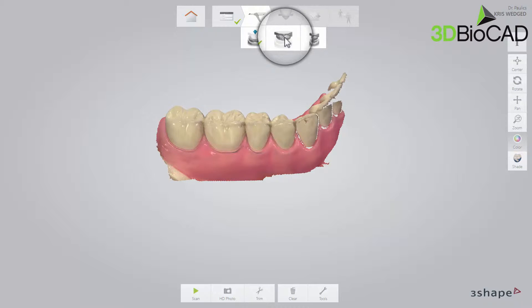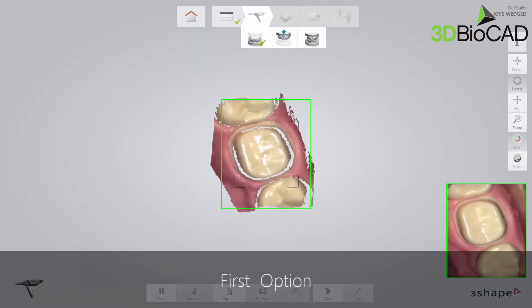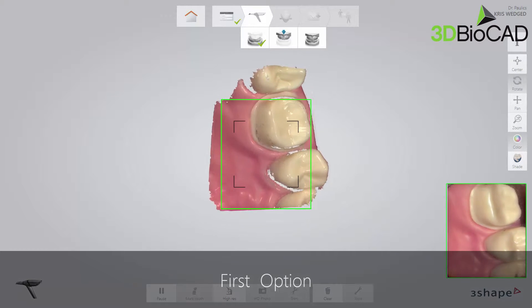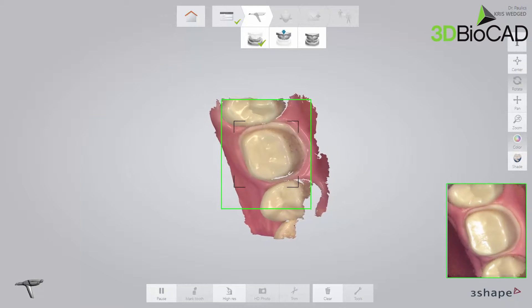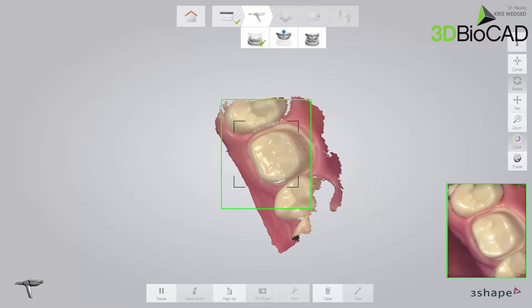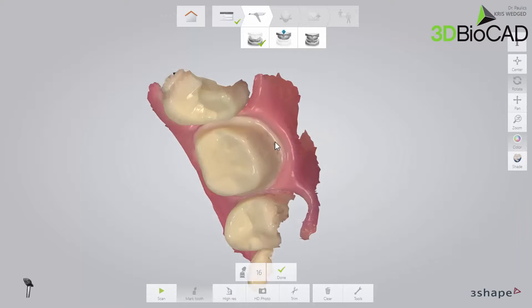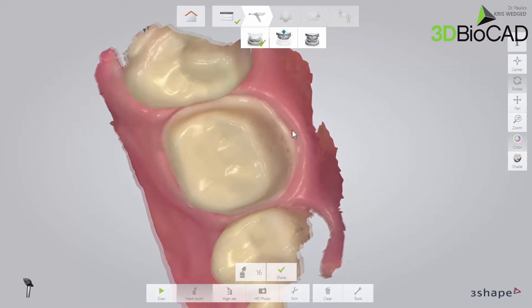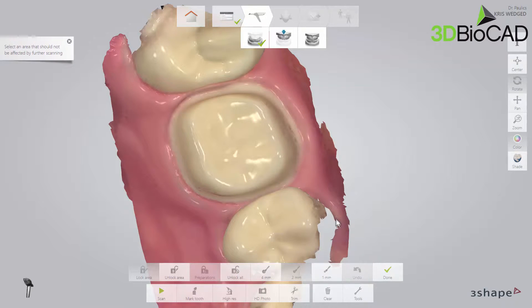Now proceed to the upper arch and scan the same area as in the lower arch. There are two ways to scan an arch with a preparation. The first option is to remove the retraction cord, dry the preparation, and immediately scan the preparation with a clear margin before the gingiva collapses. Make sure to get the margin covered well.